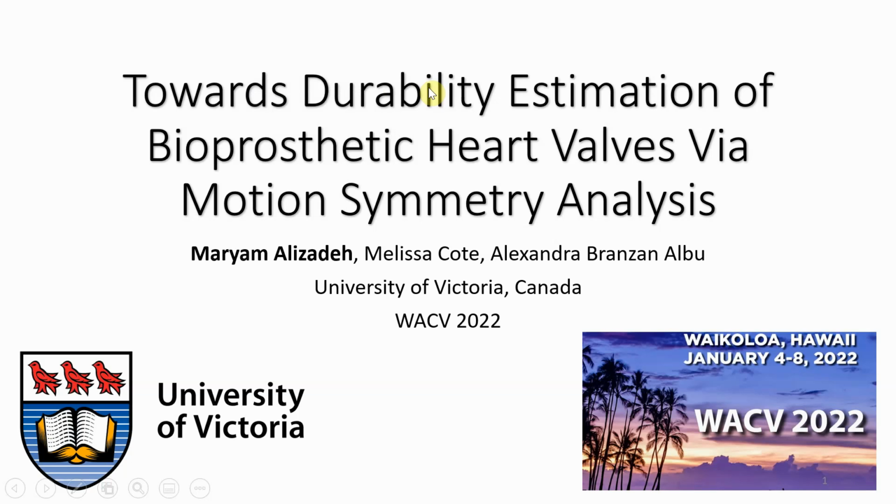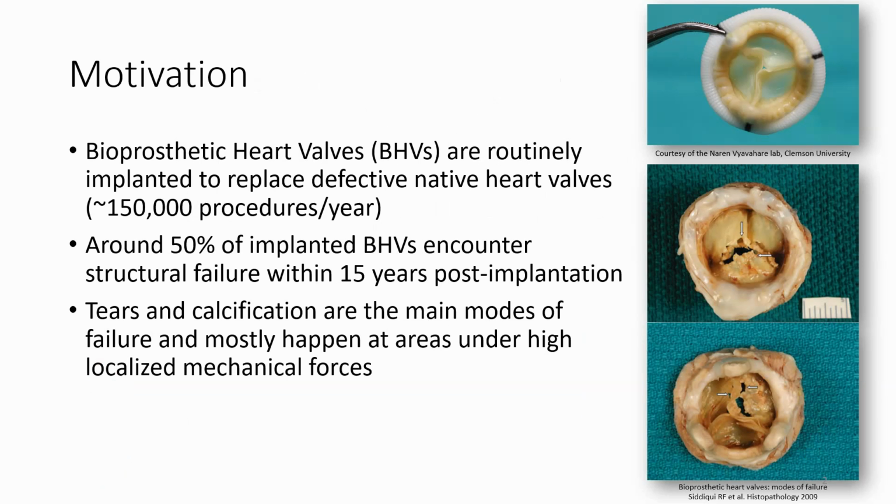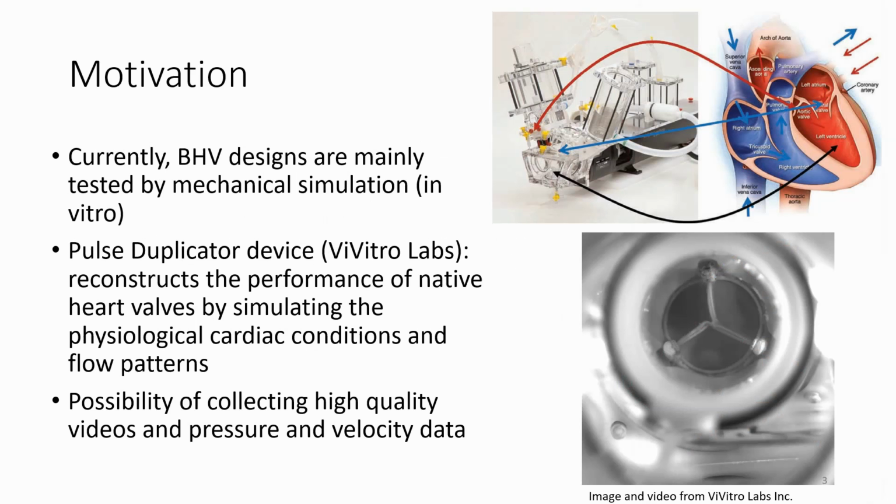Hello, I'm Maryam Alizadeh from the University of Victoria, and I'm presenting our work on durability estimation of bioprosthetic heart valves, or BHVs, via motion symmetry analysis. BHVs are routinely implanted to replace defective heart valves. Tears and calcification are the main sources of failure, mostly happening in areas under high localized mechanical forces.